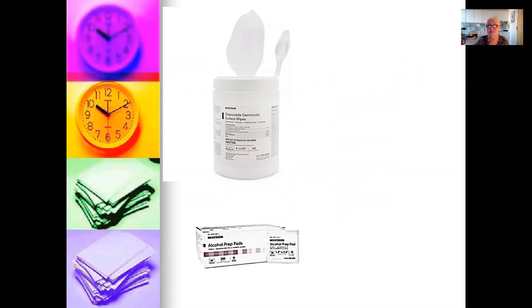And then if there is anything left, you can wipe it off with a dry paper towel or a soft cloth. Normally, alcohol dries quickly, and that's why they prefer alcohol. It goes into the air. It doesn't stay on anything for very long. And this is what we use to clean our instruments. Remember that we do need to clean our instruments in between patients.